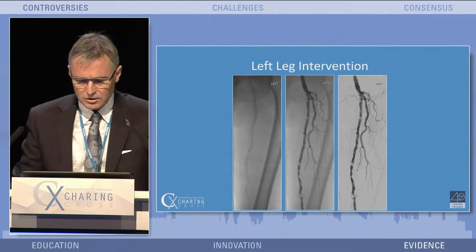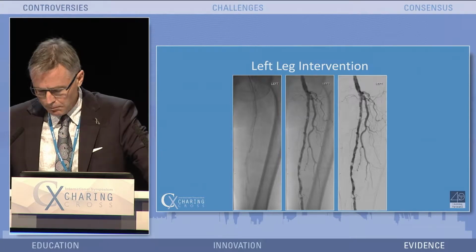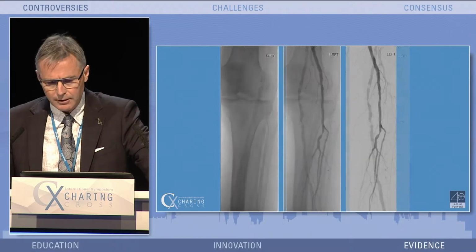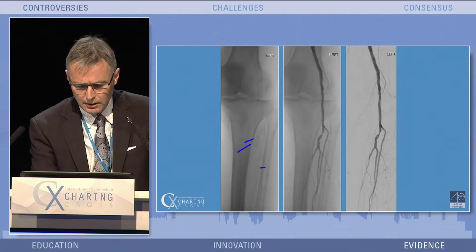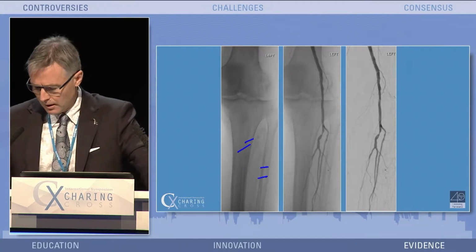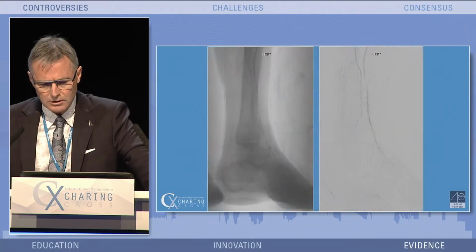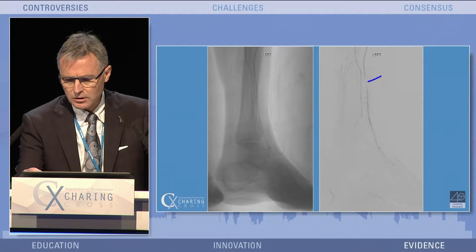Look how severe this calcium is. This is a little bit different to the one that Thomas showed, but this is real-world, multifocal, both concentric and polypoid calcification, and you can see it on the left all the way down into the popliteal artery. Not only that, look at the density of this calcium here in the tibio-peroneal trunk and this typical linear calcification that we see, medial calcification in the anterior tibial artery. So this is just a different view of that calcified stenotic disease. And you can see that the anterior tibial artery has this further stenosis here.